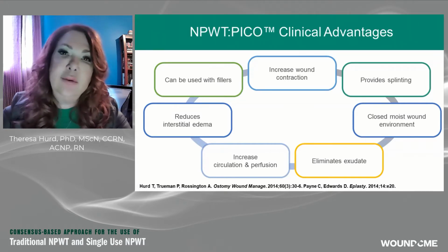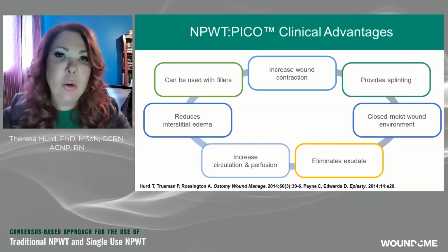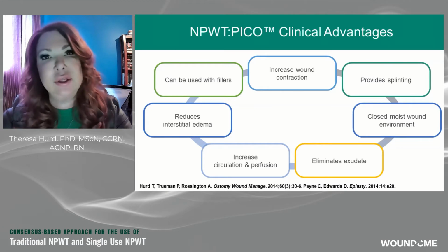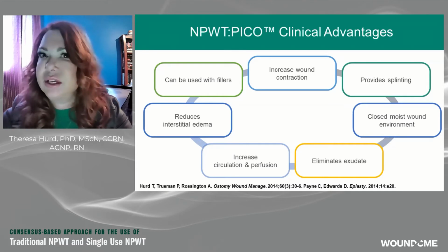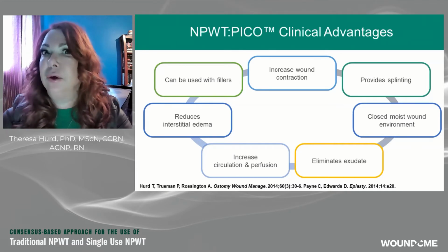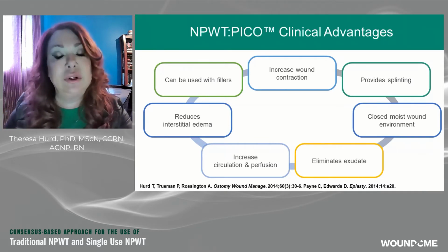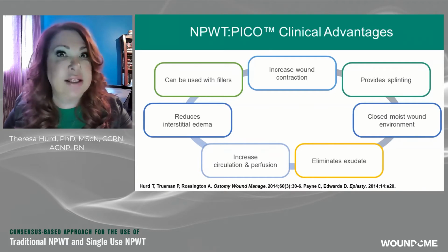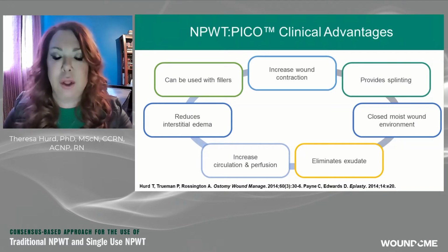And what we found, because it wasn't just me, I work with many clinicians, was that PICO actually, in fact, gives you the same outcomes that we would expect for negative pressure. Except the difference is you don't have that bigger machine. And I'll show you some pictures later of it. If you're not familiar with single negative pressure, then you'll see there's a big difference in the machine. There's a big difference in the actual dressing itself and the time it takes to apply that dressing. In other words, it's a simpler dressing to apply.